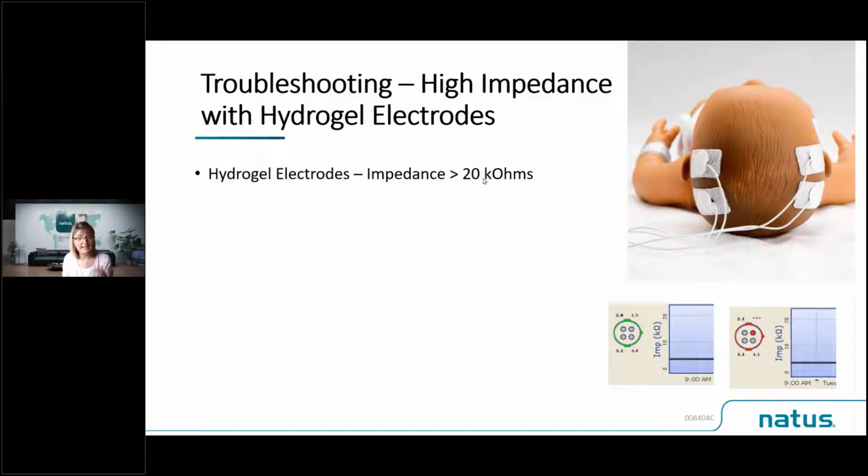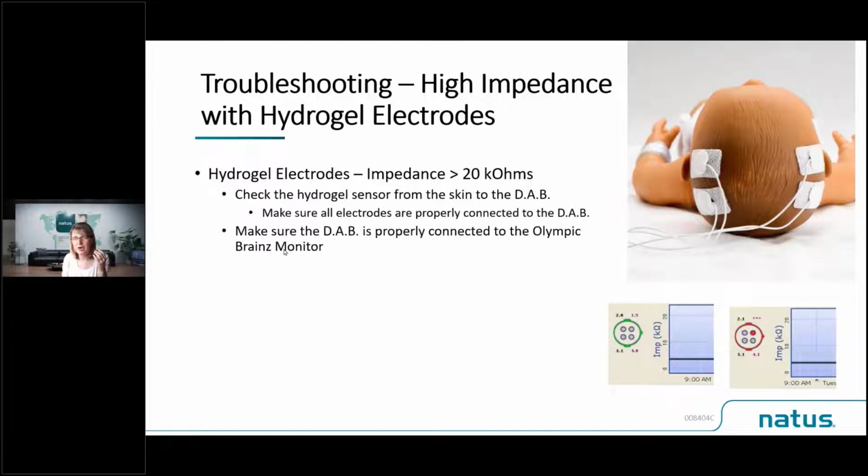So if we get that situation, we're going to check that sensor all the way from the skin all the way back to the data acquisition box. We're going to make sure all of the electrodes are properly connected to the data acquisition box. If an electrode is lifting, try to attempt to rehydrate it. Use some water to rehydrate it. And notice I mentioned water. I would request people not to use saline for rehydration.